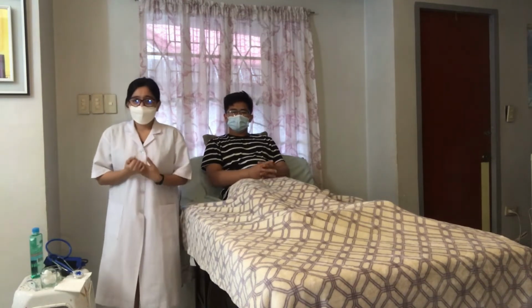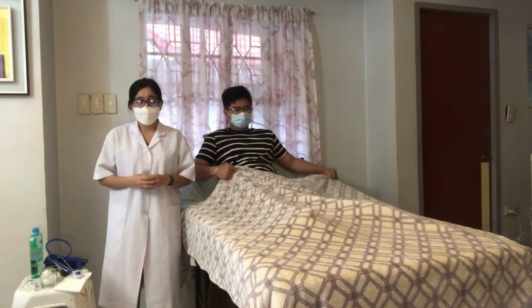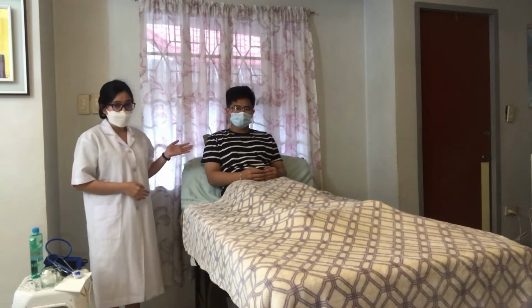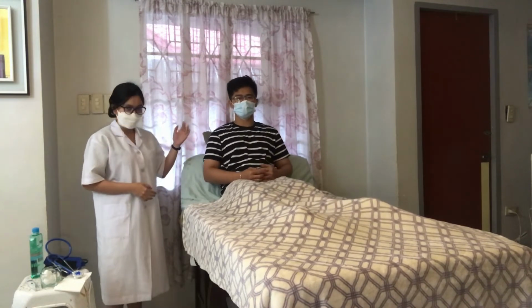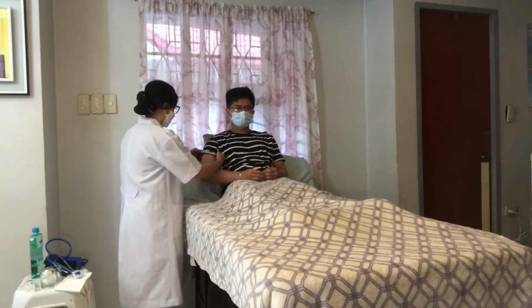Now, in taking the body temperature of the patient, we must expose the patient's axilla by securely folding the client's shirt sleeve or gown up to the deltoid region. Going to fold this, sir.